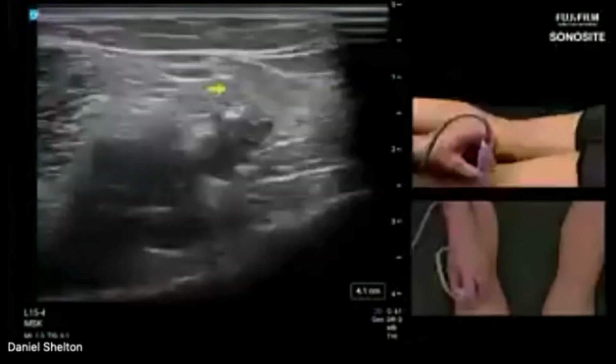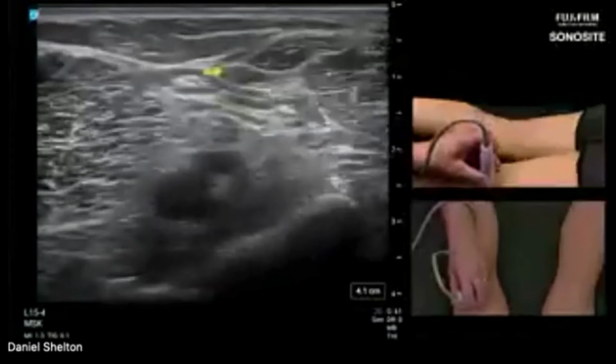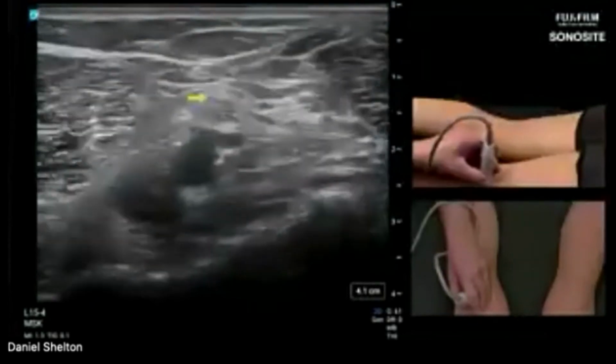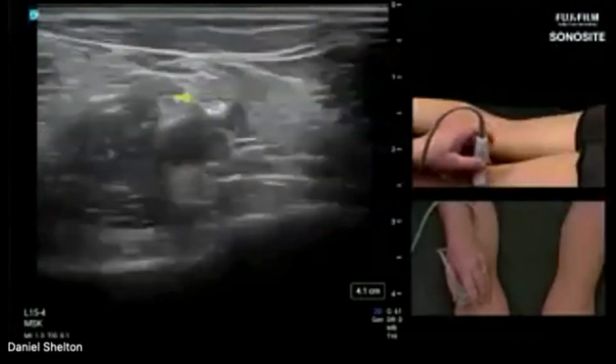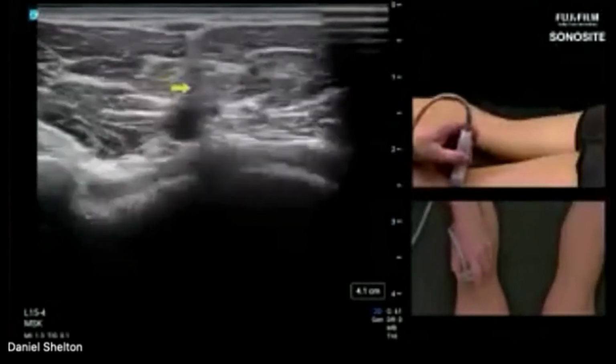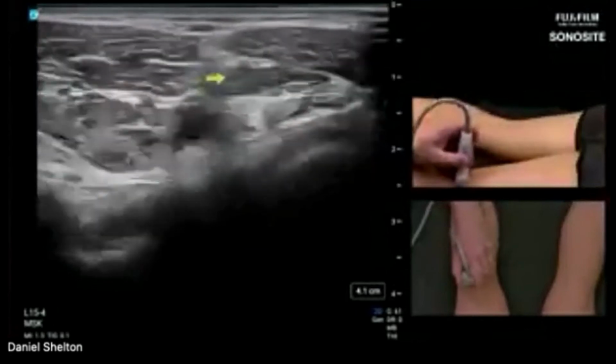So if I go up here proximally, the subcutaneous fat will enhance the nerve just a little bit. It's better than the walls of the muscle, but nothing makes a nerve look better than enhancing what it looks like through a muscle.